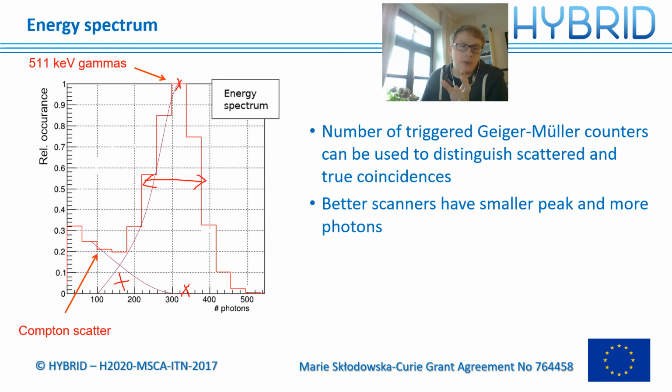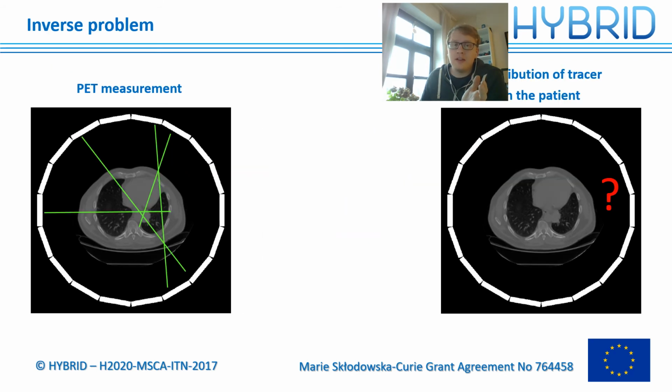Well, you could, but then you would have to set a threshold here, and then you would reduce your sensitivity greatly because you would just measure half of the particles. So given that, it's not that easy to totally exclude them. As I said in another video, we will focus more on this. However, let's start with what actually happens once we measure those particles.